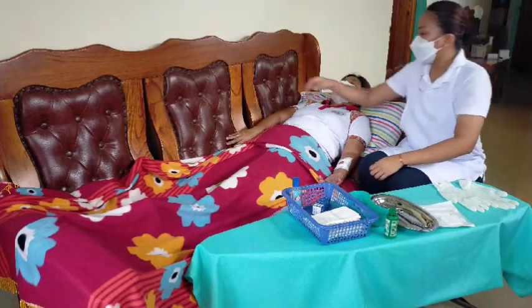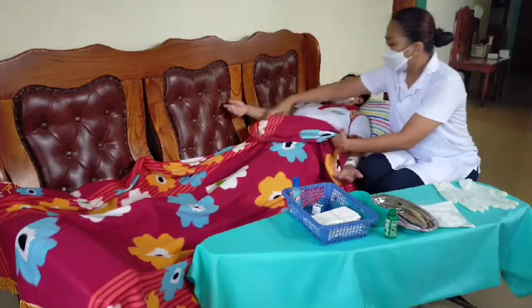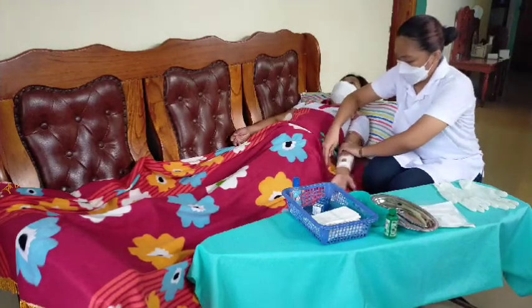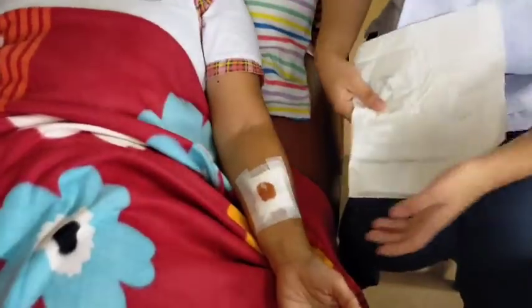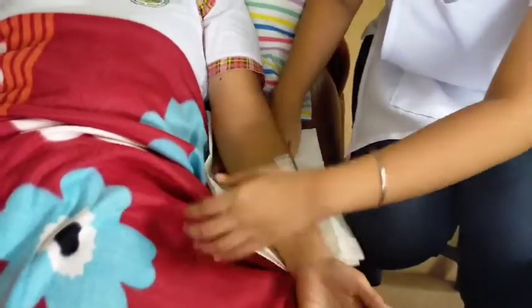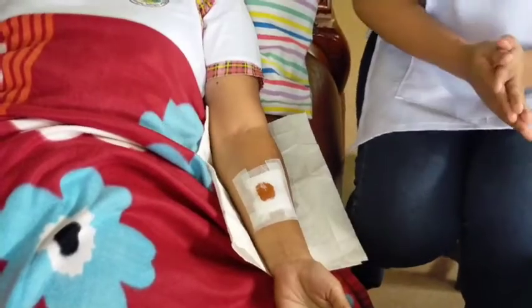Next, I am going to assist the patient to a comfortable position and use the bath blanket to cover any exposed area other than the wound. And now, I'm going to place a waterproof pad under the wound site. And we're going to check the position of drains, tubes, or other adjuncts before removing the dressing.